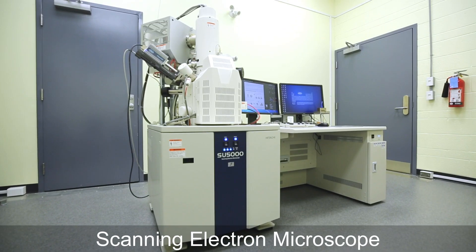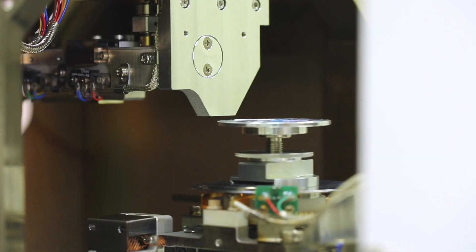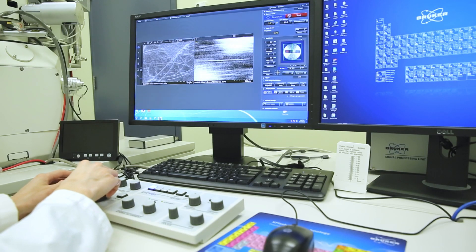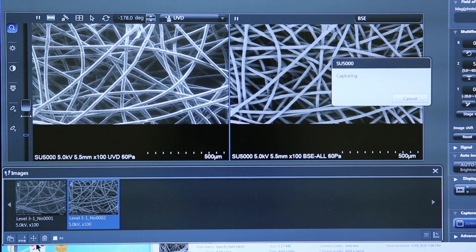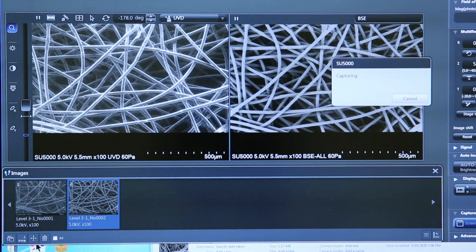To see the structure of the mask materials at a high magnification, I use the scanning electron microscope, which offers significantly higher resolution than a conventional light microscope.